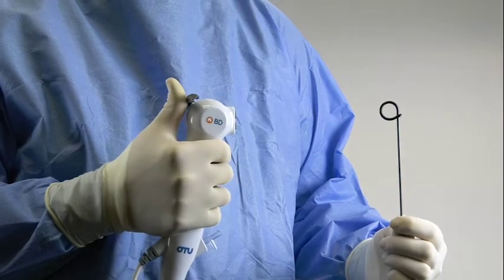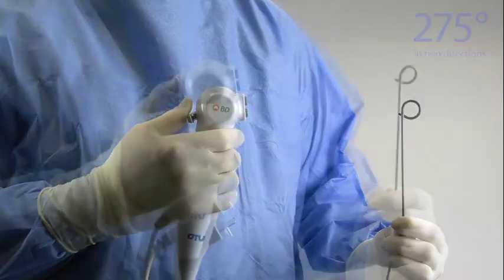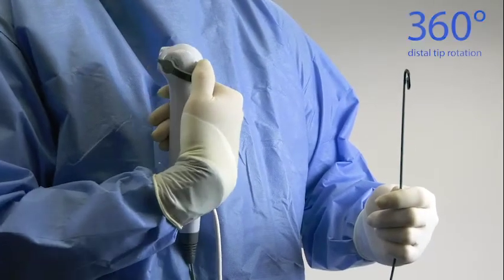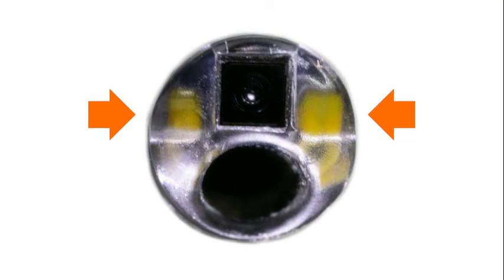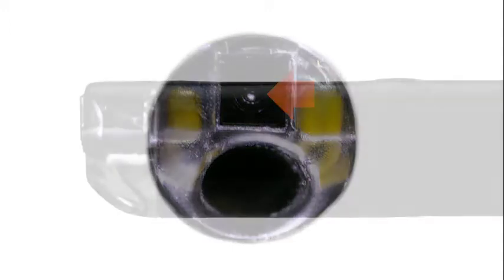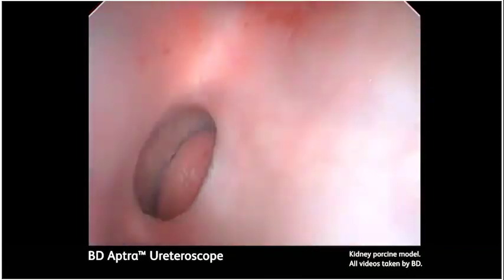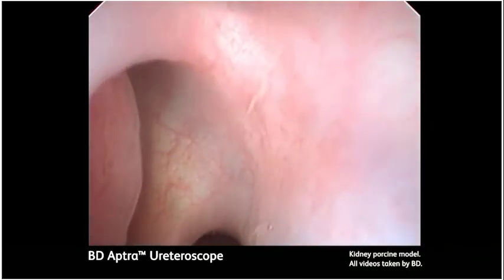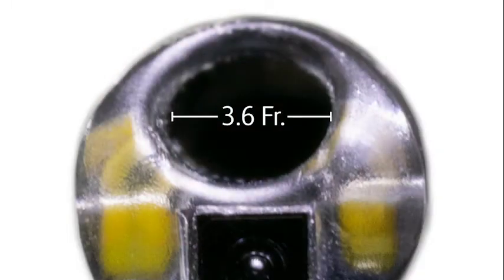The distal tip of the BD-APTRA single-use digital flexible ureteroscope deflects 275 degrees in two directions. The distal tip can be rotated a total of 360 degrees by rotating the handle. There are two LED lights located in the distal tip, as well as the opening to the 3.6 French working channel and a video camera that generates a digital image. The diameter of the distal tip is 7.4 French. The video camera provides a 100-degree field of view and a depth of field from 2 to 50 millimeters.